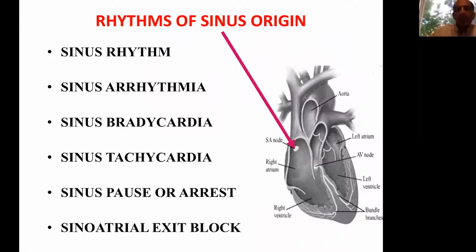Now, the electrical activation of the heart, as you can see in the cartoon over here, starts from a structure called the sinus node, which is where all electricity from the heart starts. And then that spreads to activate both the upper chambers of the heart, which is the right atrium and the left atrium. Then the conduction goes from interatrial through to the AV node.